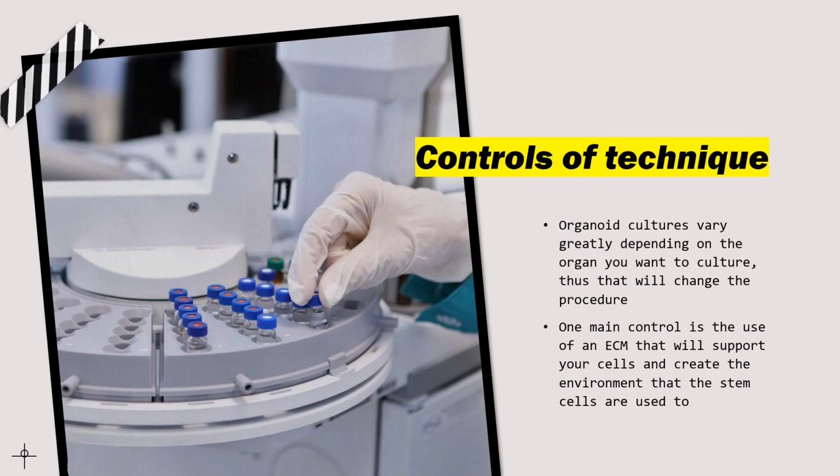The controls of this technique greatly vary, just depending on the organ that you want to culture and the cells that are included in that. And so that's going to change the procedure. So I never really found any controls within the literature, but the one main constant that I found, and in a way it's a control, is that the use of an extracellular matrix that will support your cells and create the environment that the stem cells are used to is really important.